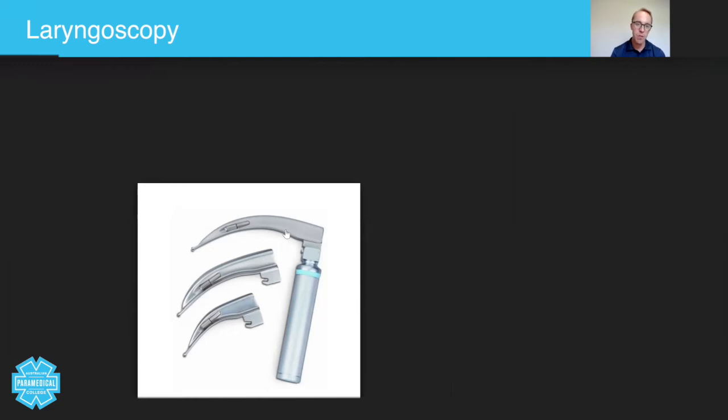Now, you get to practice this in workshop two. But just for now, let's be clear that there's this thing called a laryngoscope blade, which is this part, and a laryngoscope handle.